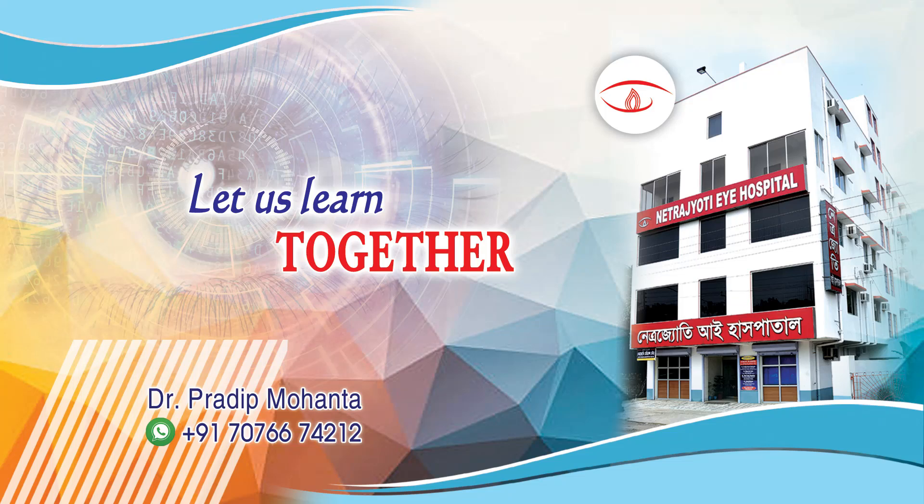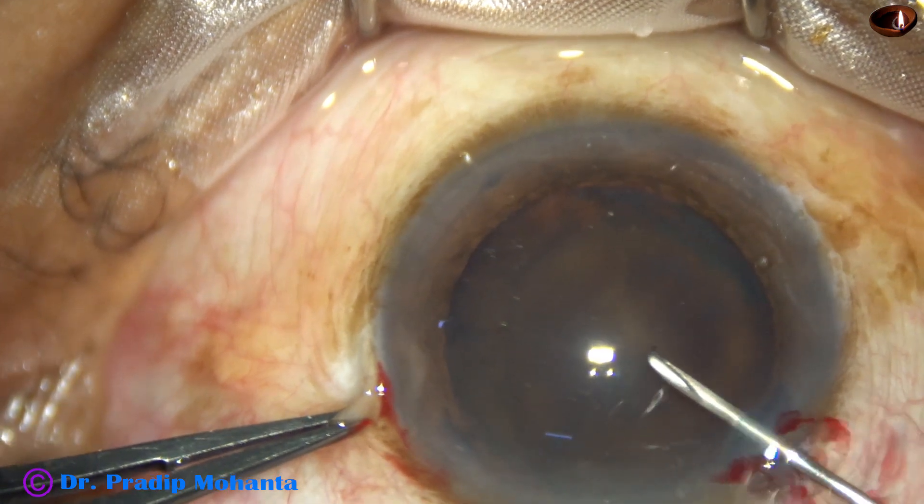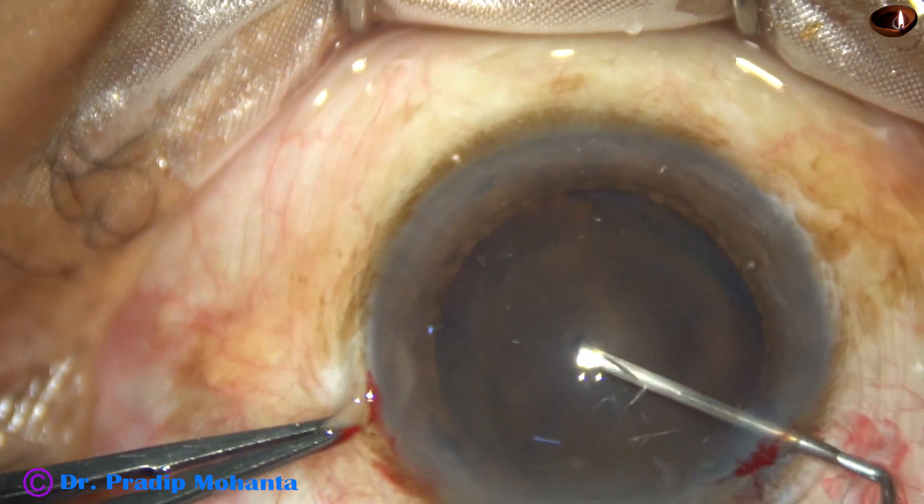Friends, welcome to my workplace at Ranaghat, West Bengal, India. This is a hard brown cataract with zonular dehiscence from 1 o'clock to 6 o'clock — 5 clock hours. Let us see the management of this case.